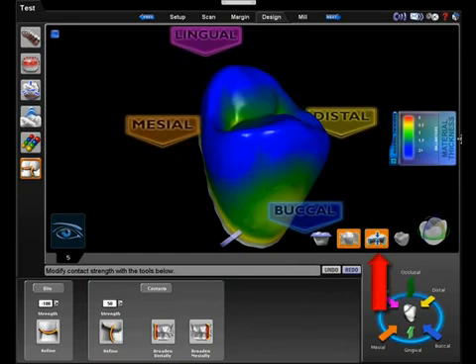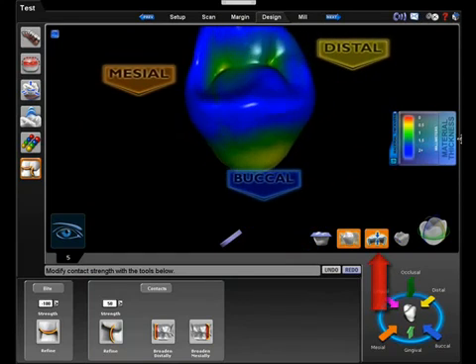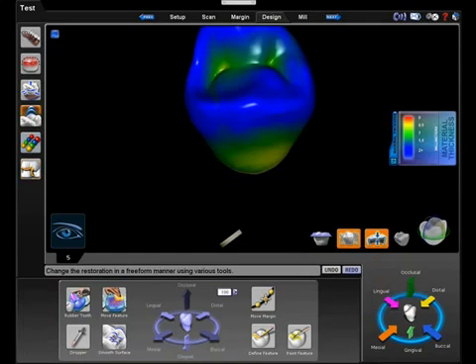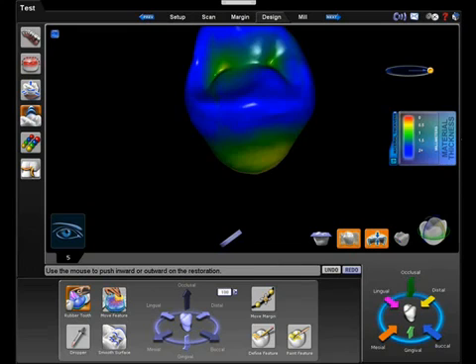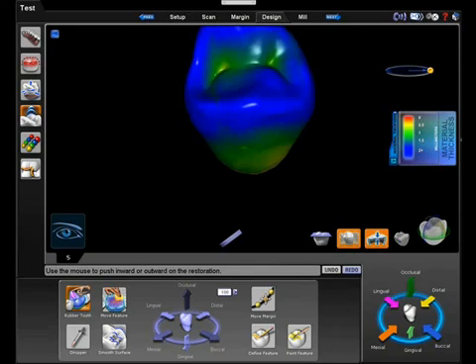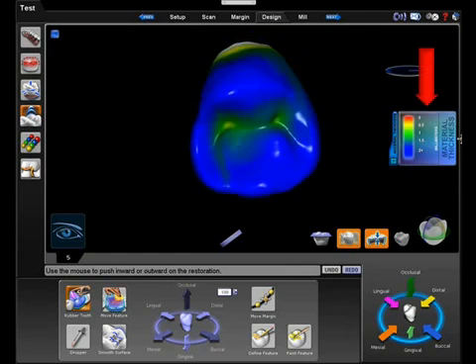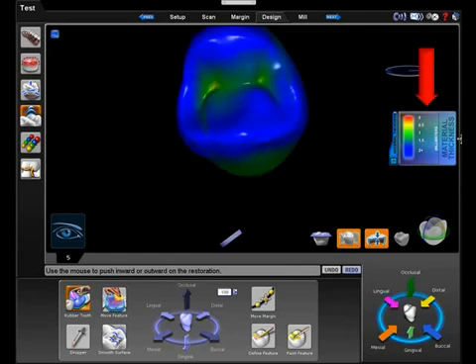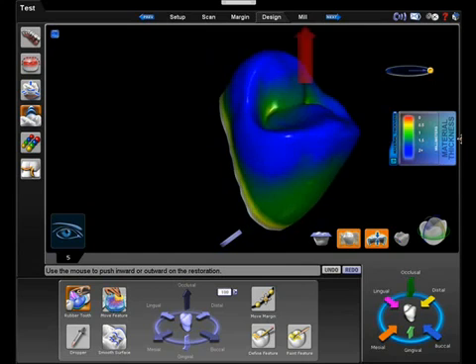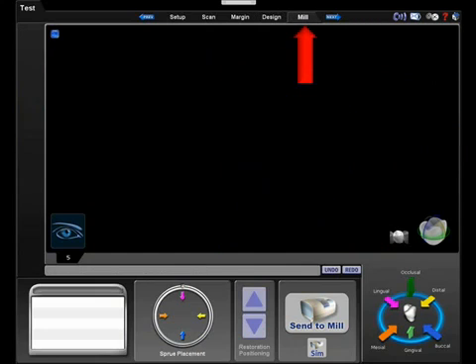Checking material thickness is important to ensure the quality of your restoration. The color legend on the side of the screen shows us how much material thickness we have. Once we are satisfied with our design, we can click on the mill tab.